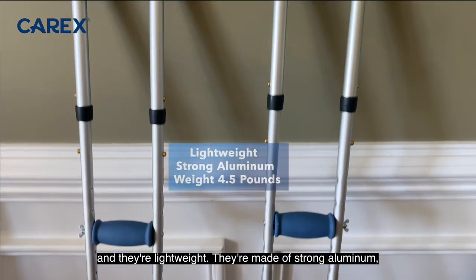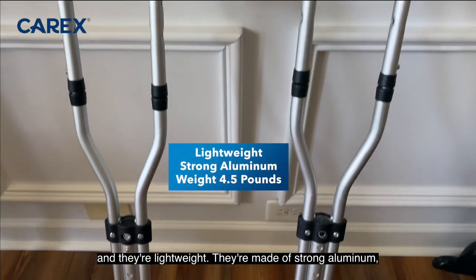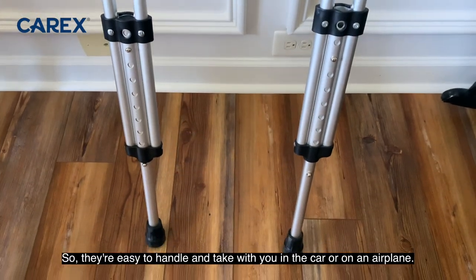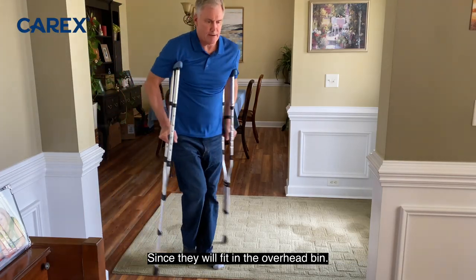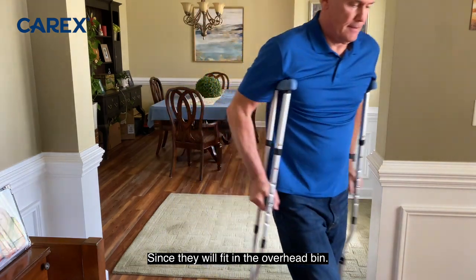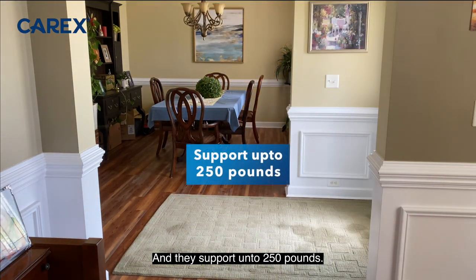They're lightweight — made of strong aluminum but weigh just four and a half pounds. So they're easy to handle and take with you in the car or on an airplane, since they'll fit in the overhead bin. And they support up to 250 pounds.